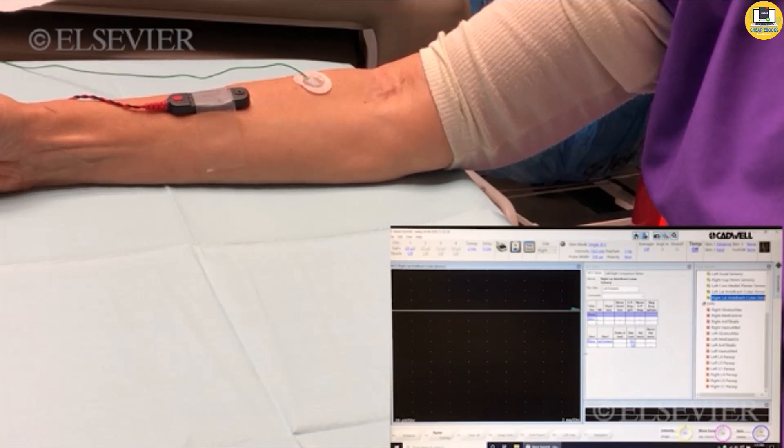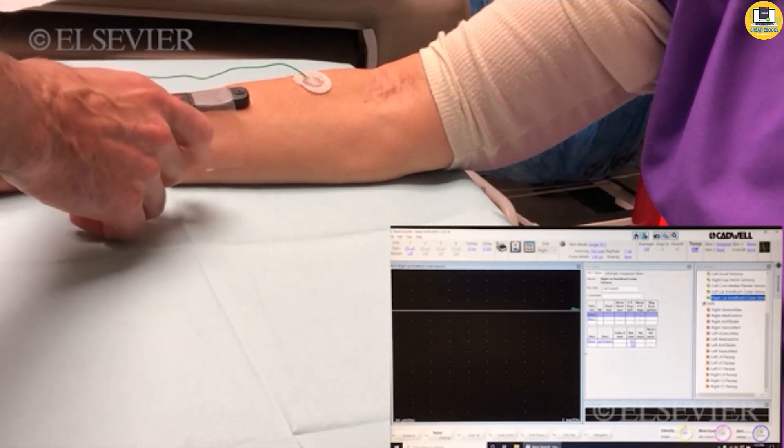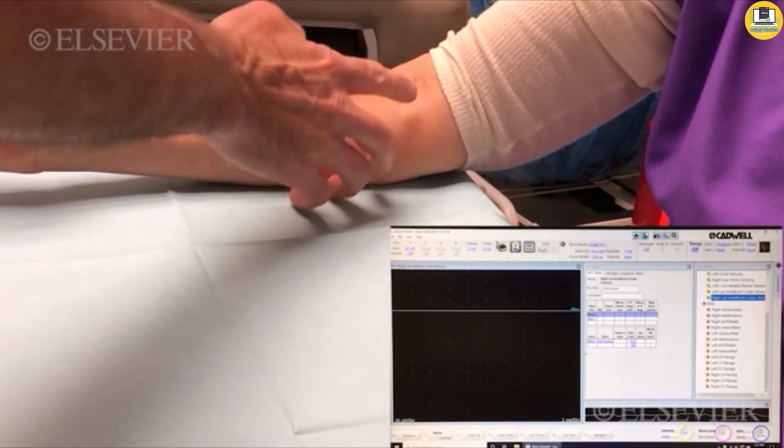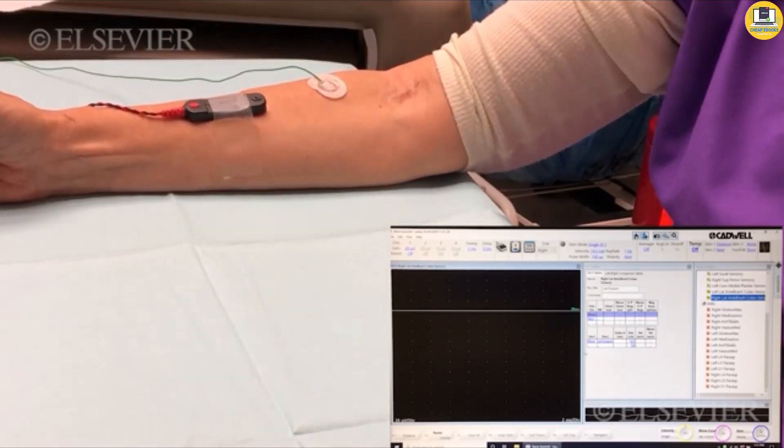These studies are performed with an active electrode about halfway between the radial styloid and the elbow, just lateral to the biceps tendon. Sensory settings are utilized.